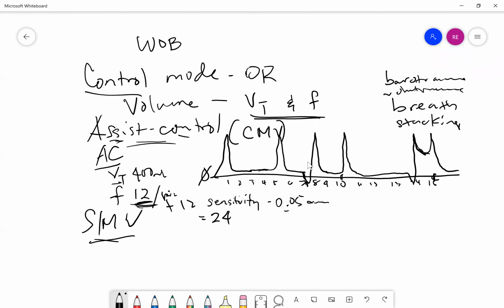So monitor ABGs. If we see respiratory alkalosis, that means the patient is taking more breaths. Or for this one, the patient usually goes restless here. The patient may become restless, agitated, and if not appropriately sedated or you have no bite block, the patient will bite the ET tube, because they're so uncomfortable.